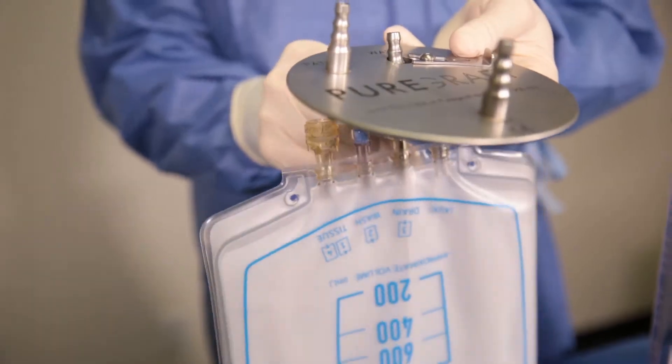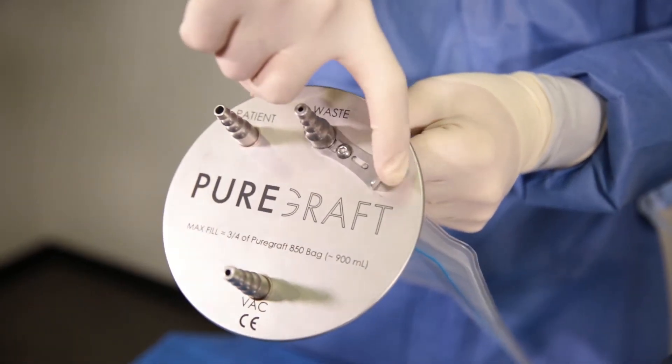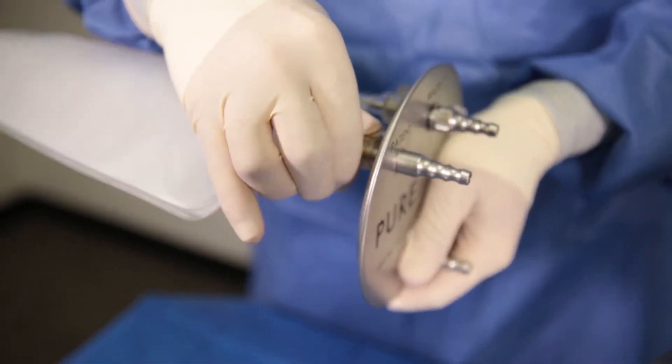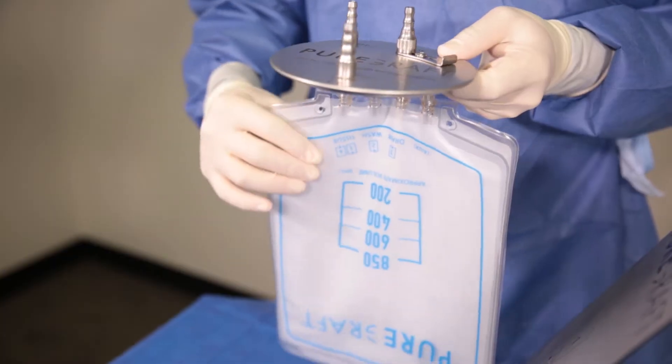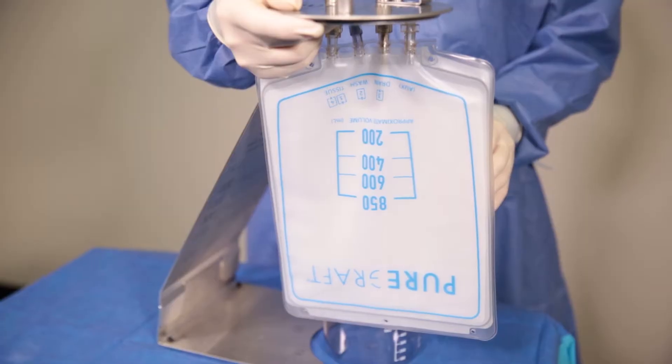Now, connect the PureGraft 850 to the lid base, lock the metal slide fitting, and firmly press the tissue port of the 850 system onto its metal fitting. It is important that this port is securely seated to ensure the connection does not separate during the harvest process.